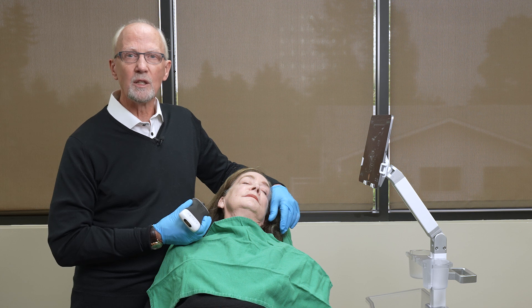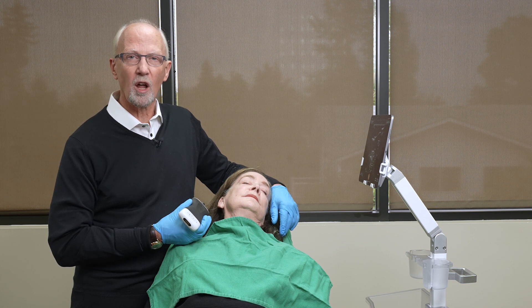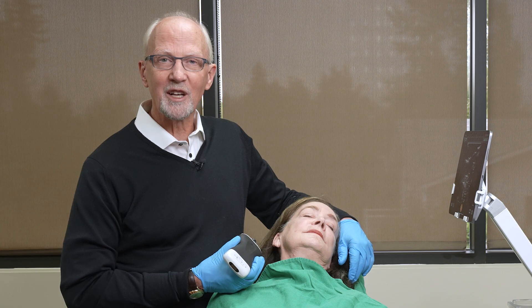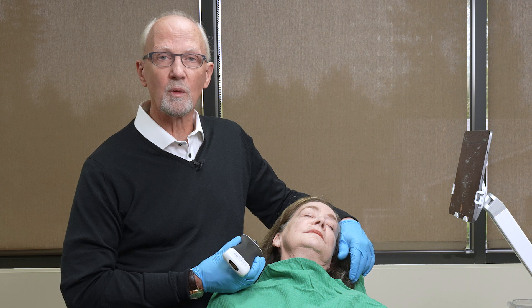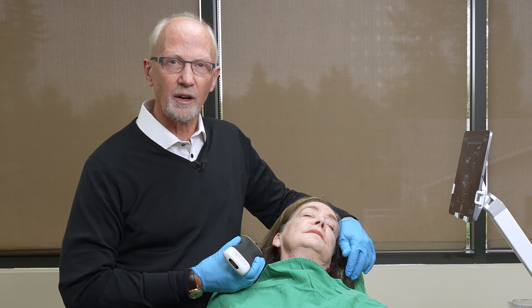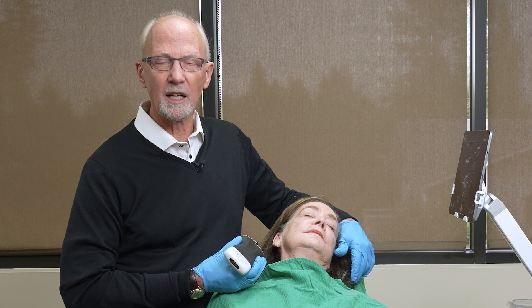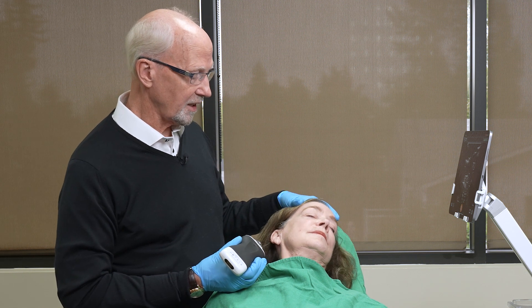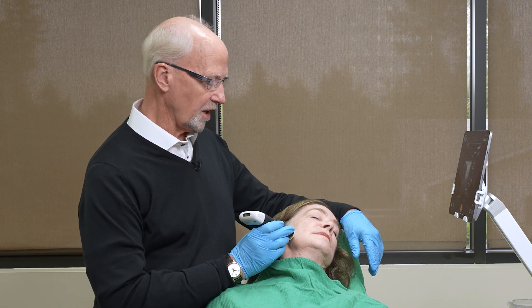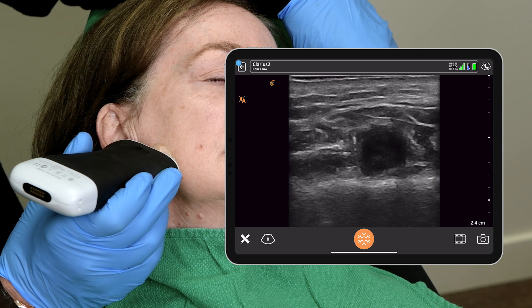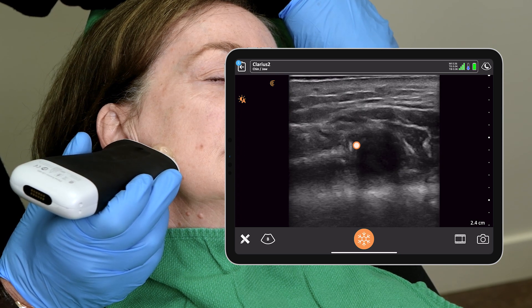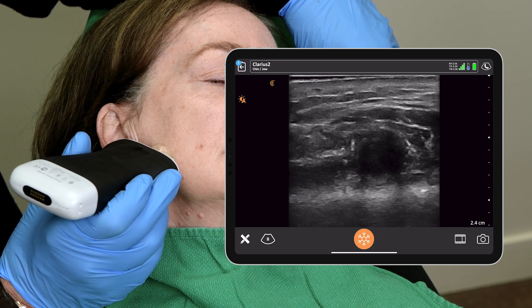Today we're here to aspirate what's left within this small loculated area and show you ultrasound guided intervention — aspirating it, after which we will put some hyaluronidase directly into the area to dissolve any remaining filler. We can see here that we have an anechoic area at the base of the masseter, right on top of the mandible.